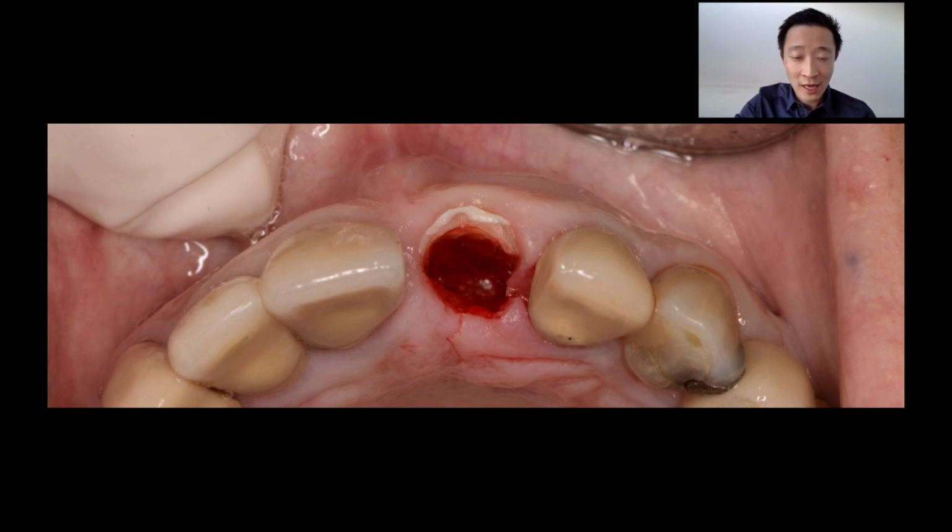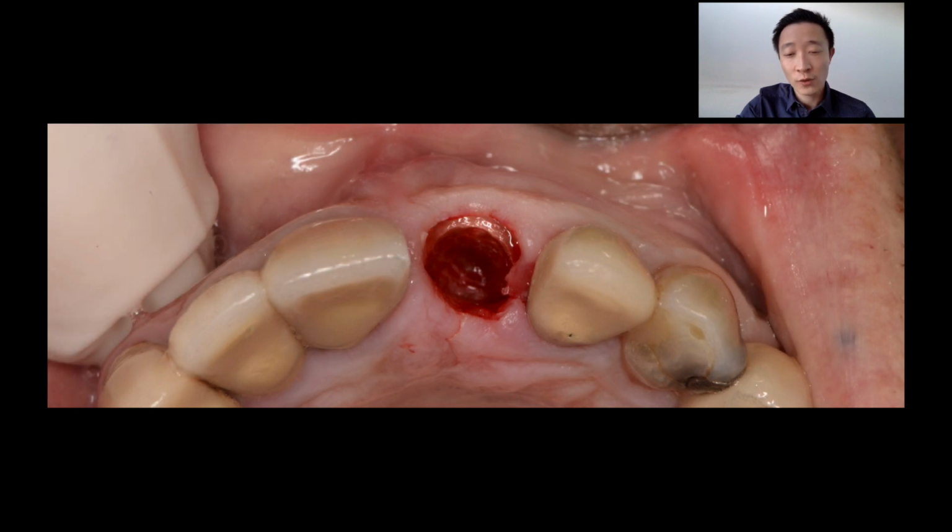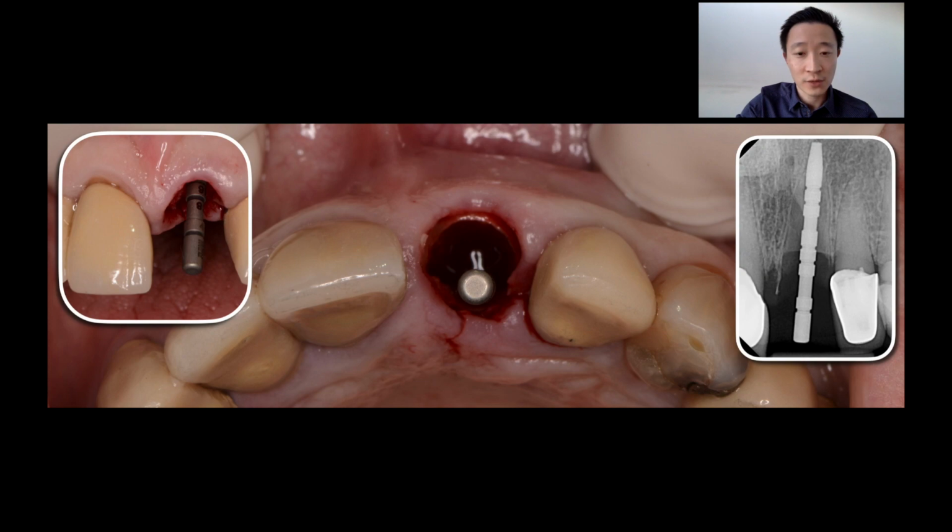But by this point, we have trimmed away most of the palatal portion. As you can see, the shield is starting to take this crescent form on the buccal. What's important as you're doing this is that you make sure that there is no movement of the shield, as that is a contraindication for this treatment. So by this point, I've reduced the shield to the final parameters, and we are ready to start with the implant positioning or implant drilling.